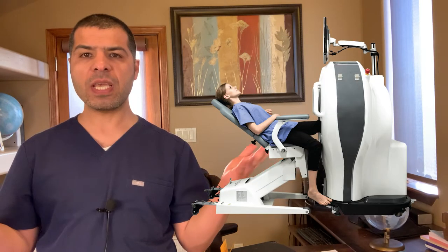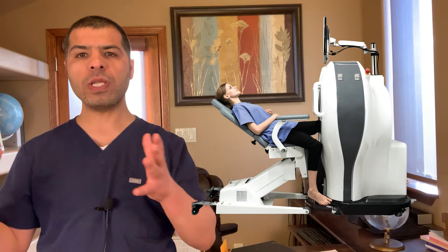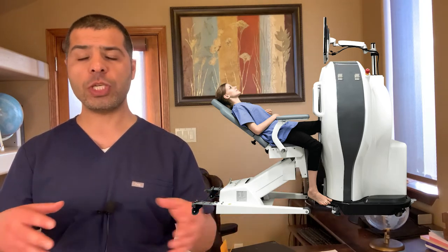Second, open MRI. These are open and lack that cylindrical tube, which can be ideal for claustrophobic patients and morbidly obese patients who cannot fit in the closed MRI. The quality of images, though, is less compared to closed MRI. And third, extremity MRI. As you see in the picture, only the extremity goes into the machine. So make sure to know what MRI machines your facility carries.